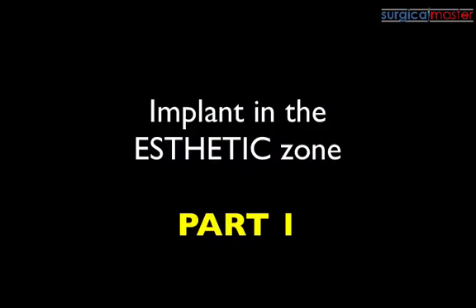Doctors are starting to understand my philosophy of extraction and bone grafting. I focus on a least traumatic extraction process. I decide when I reflect the flap, when I don't. For most of those blowout cases where I lose some of the buccal plate or it's lost to begin with, I expose the buccal plate, do good debridement, and use the compartment technique to complete the missing compartments, mostly the buccal plate and the occlusal part, the sealing of the socket, and we get pretty good tissue and bone.